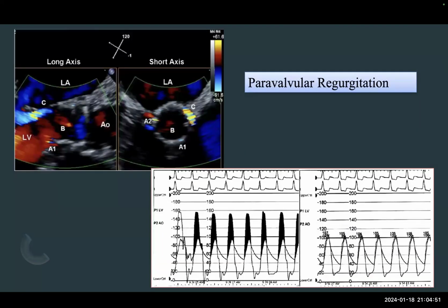As a complication, they may show you this tracing, and here you see the diastolic pressure, here the left ventricular end diastolic pressure, and here the systemic diastolic blood pressure. After the implantation, the blood pressure is reduced, which is good, which means there is no aortic stenosis.